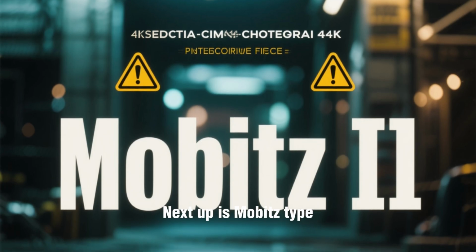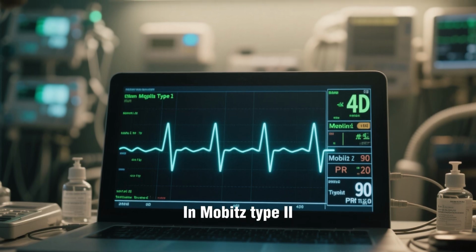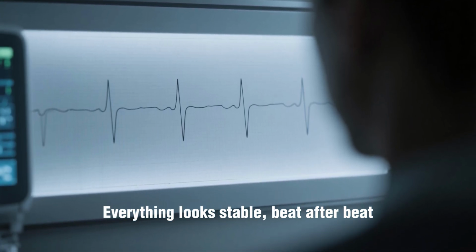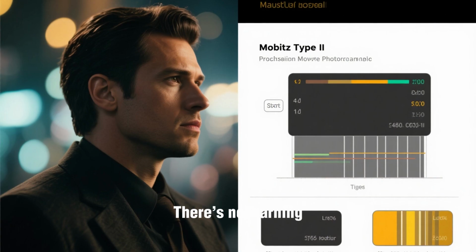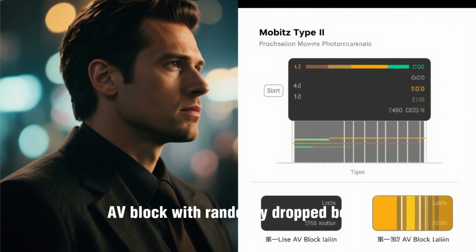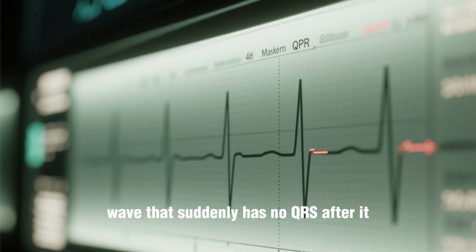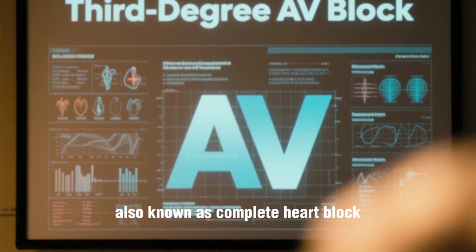Next up is Mobitz Type 2. This one is much more unpredictable, and therefore, more dangerous. In Mobitz Type 2, the PR interval is prolonged, but it's constant. It does not get longer with each beat. Everything looks stable, beat after beat, until suddenly, out of nowhere, a QRS complex is dropped. There's no warning. Because of this, you can think of Mobitz Type 2 as a first-degree AV block with randomly dropped beats. On the EKG, you'll see those fixed, long PR intervals, followed by a P wave that suddenly has no QRS after it.